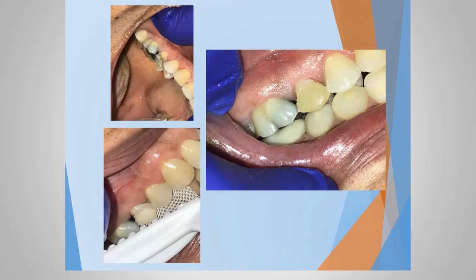In this case, we're looking at tooth number 4 with a broken buccal cusp. I'm placing the material on the buccal aspect of this tooth, and this is a picture of it in place. You can shape this with your fingers, or you can shape it with a plastic instrument. It lends itself to easily being manipulated into any kind of shape and form that you want. And because it can be light cured, it's just a quick and easy material to use. Here we go, where it's light cured and we're sizing it up to take a triple tray impression.